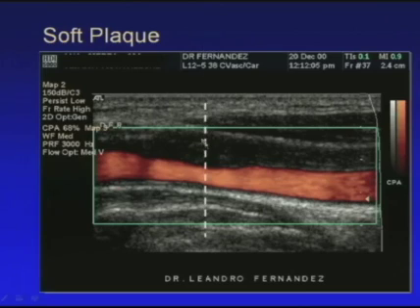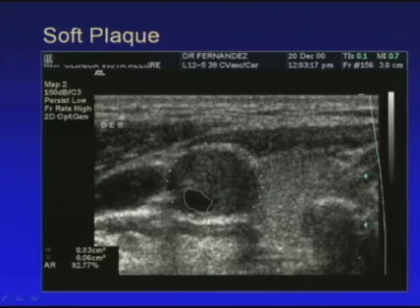If we place our ultrasonic beam in this very specific portion, and go from longitudinal to transversal, this is the kind of image that we can obtain. And here we are observing how the plaque takes almost all the lumen of the vessel with only this residual lumen.